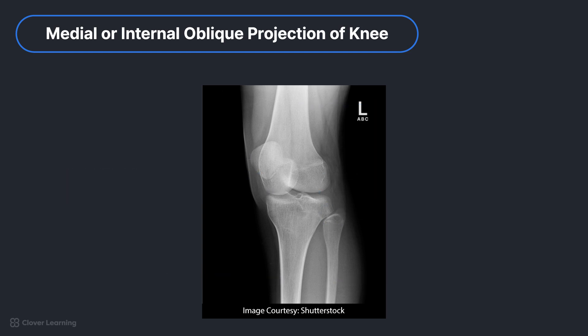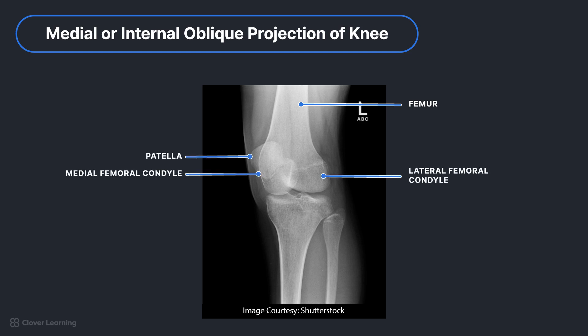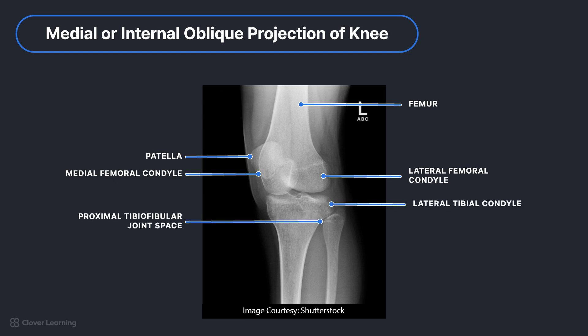Let's identify the anatomy from superior to inferior: distal femur, patella, medial femoral condyle, lateral femoral condyle, lateral condyle of the tibia, proximal tibiofibular joint, head of the fibula, neck of the fibula, and proximal tibia.